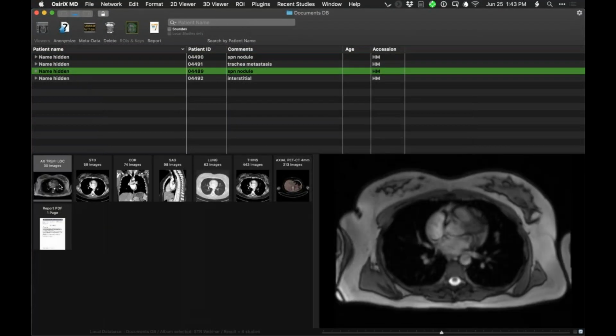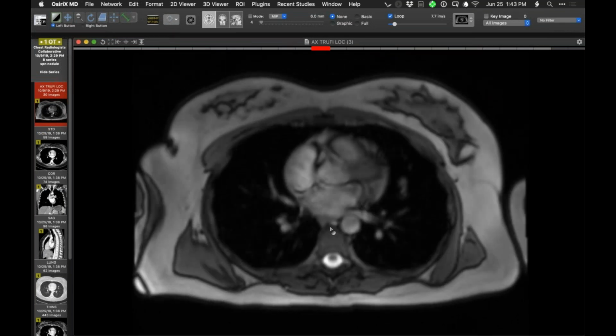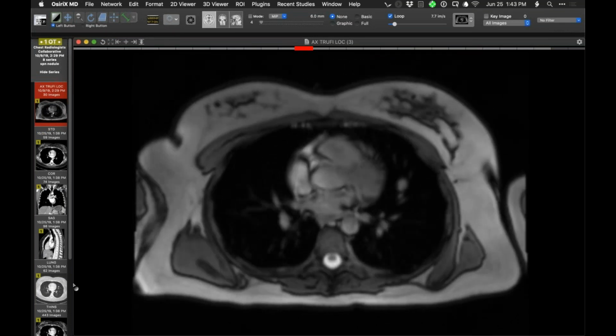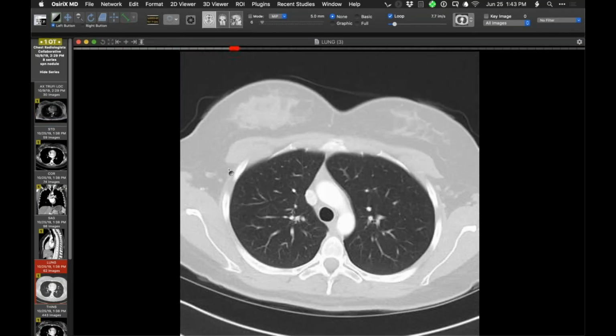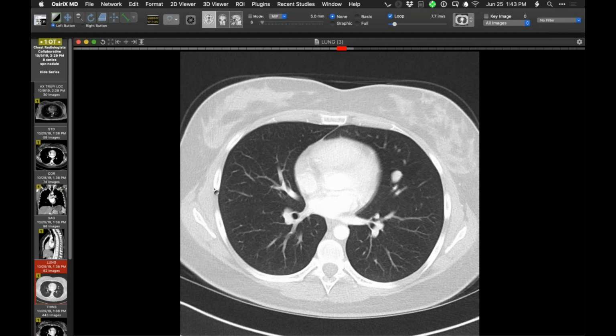Here is another nodule. This one was discovered in the context of MRI, and I can't remember why the MRI was done, but there was a nodule here in the left upper lobe. And a little while later, CT was done for further evaluation, and here it is. Small, smooth margins, no calcification within. And of course, there's a differential diagnosis for that. So we think of probably most likely things like carcinoid, hamartoma, particularly if there was any fat or calcium in. And then beyond that, there's the differential diagnosis of other causes of nodules.